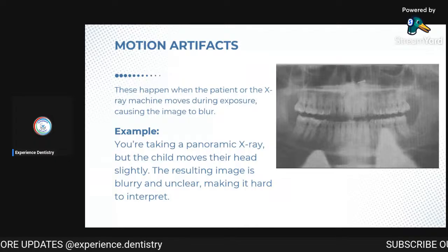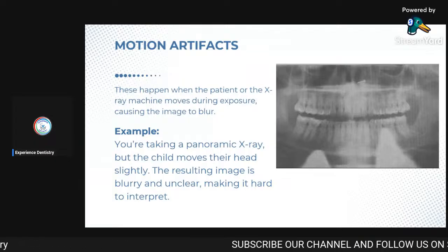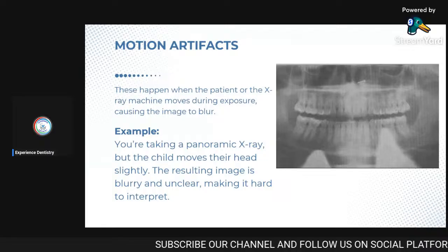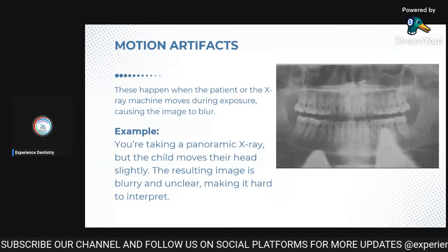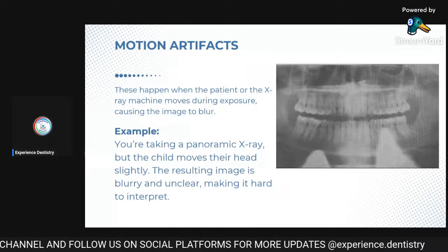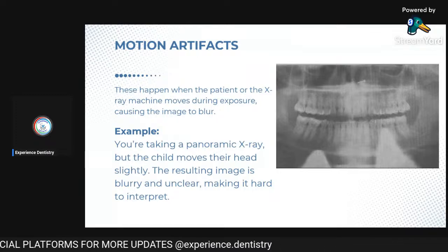What basically happens is there is a little bit of motion or movement on the operator's side, or it may be on the side of the patient as well. For example, you are taking a panoramic X-ray, basically an OPG X-ray, but the child moves their head slightly.